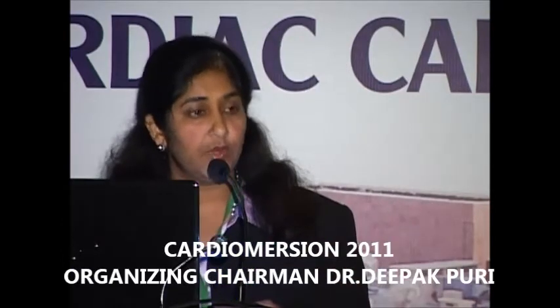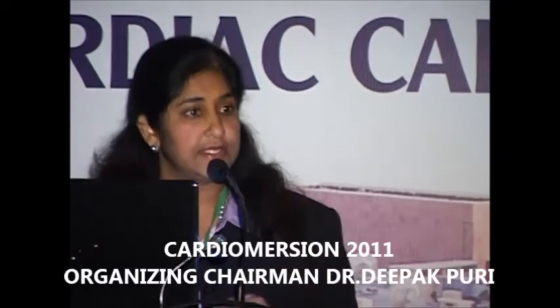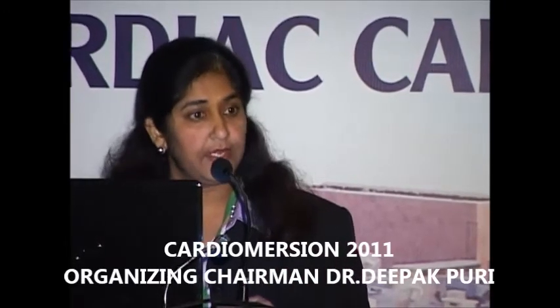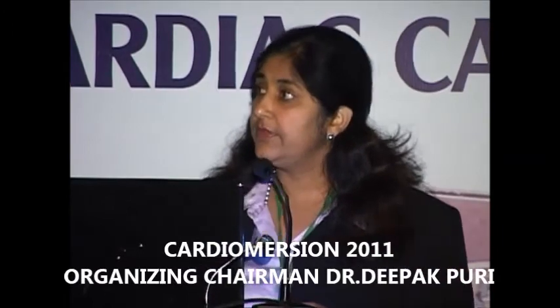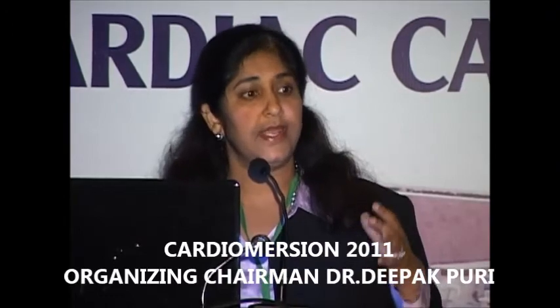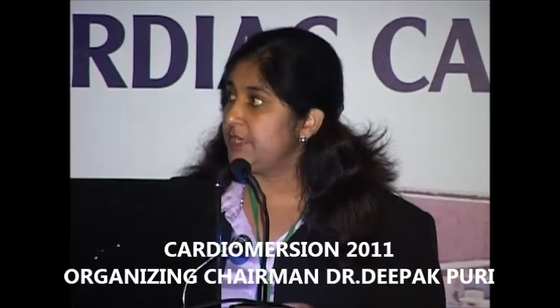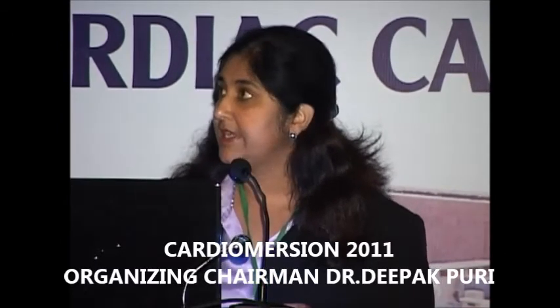So one begins to wonder: this patient is very likely to get aortic dissection, and their aortic root is a little bit dilated. Have they developed an aortic dissection or not? We had to clarify that by gating. So we imaged the aorta in one part of the cardiac cycle so that we can omit the cardiac motion. As you can see, this patient did not have any aortic dissection.